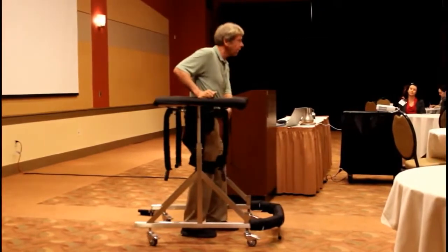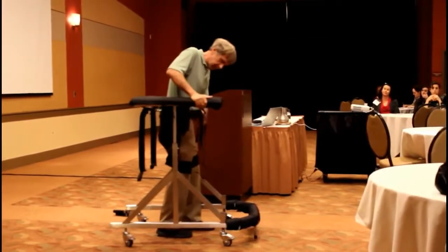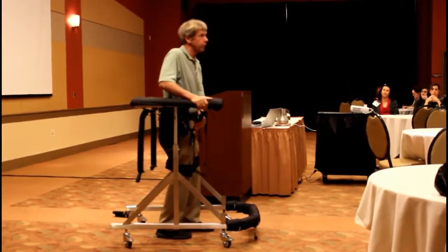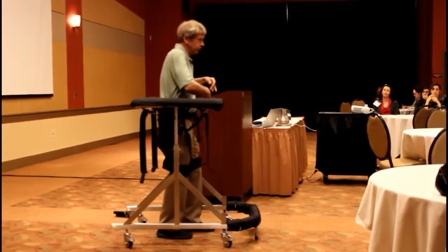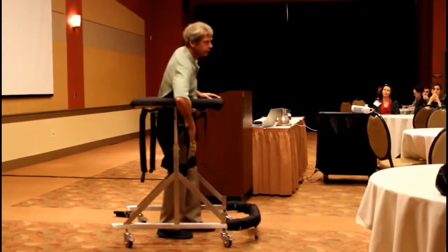But you can adjust the straps to actually counterbalance their lean. So if I pull down on the strap, I can loosen one in the front, and then if somebody's leaning a lot in one direction, counterbalance.